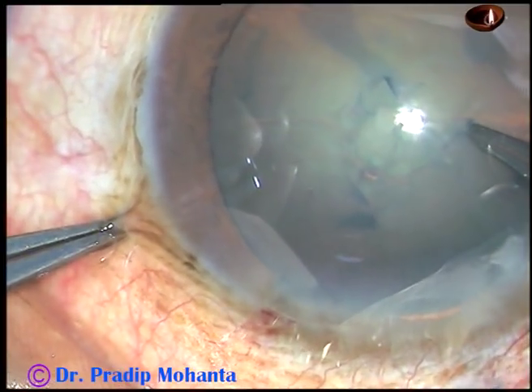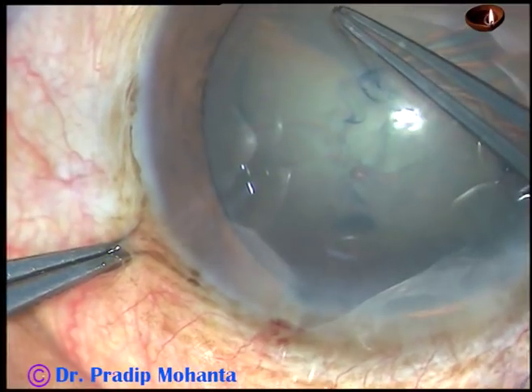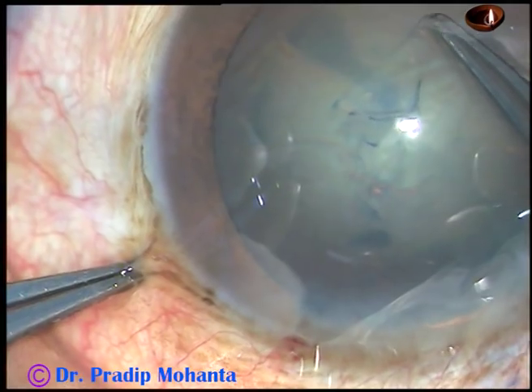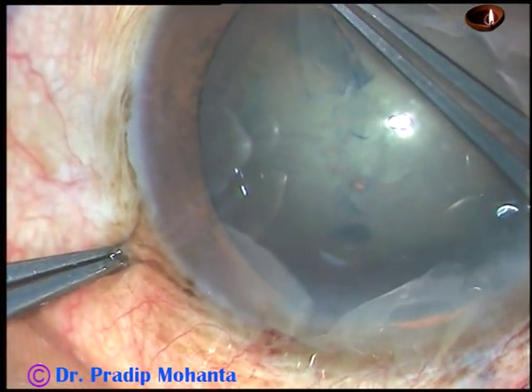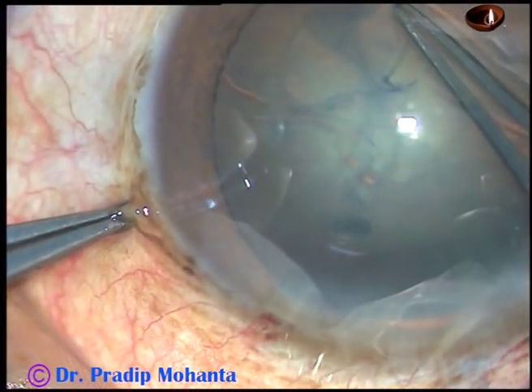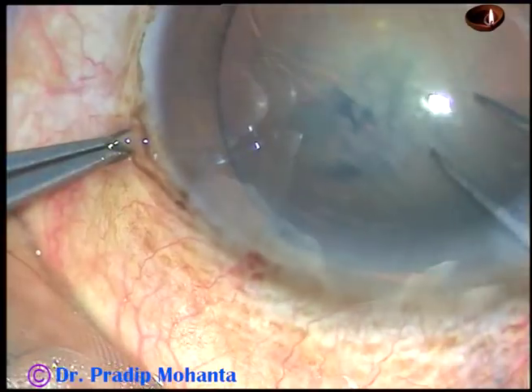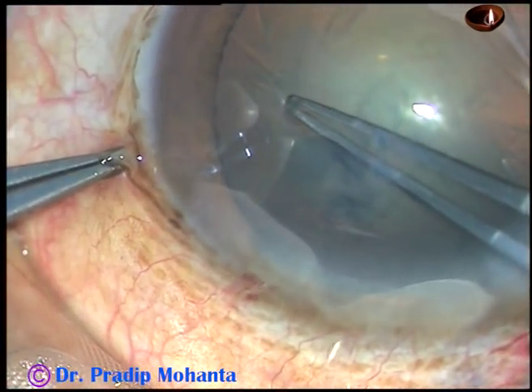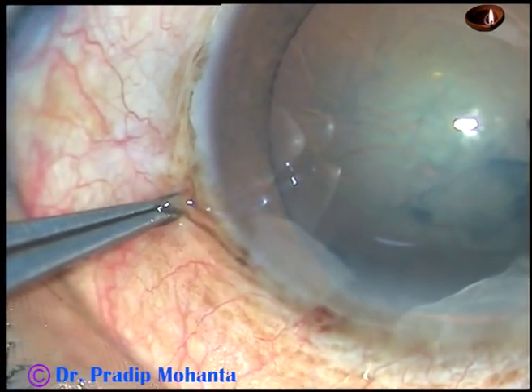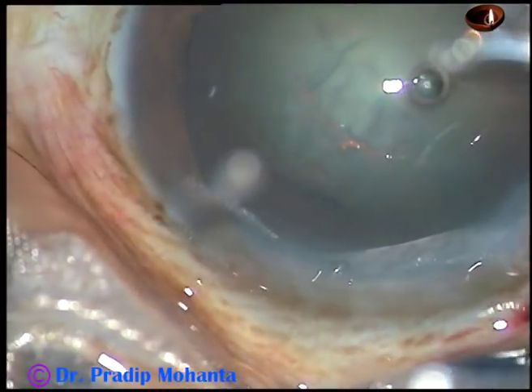Now very gently and very slowly I am guiding it to do a continuous curvilinear capsulorrhexis. Continuous curvilinear capsulorrhexis is very important because I want to apply a capsular tension ring — a CTR — in this case.